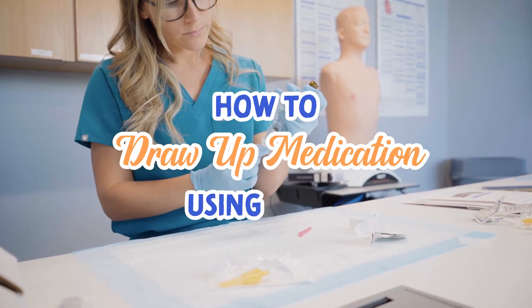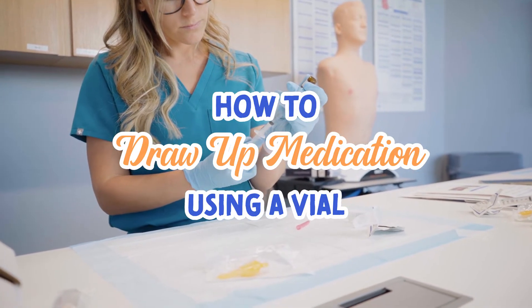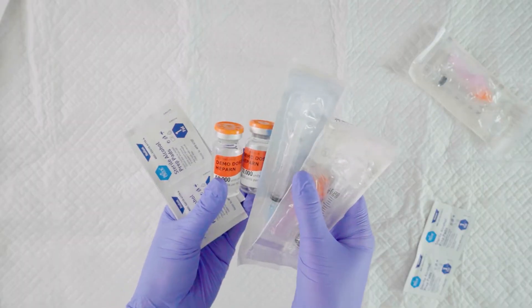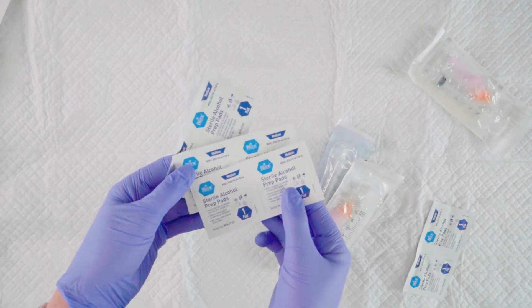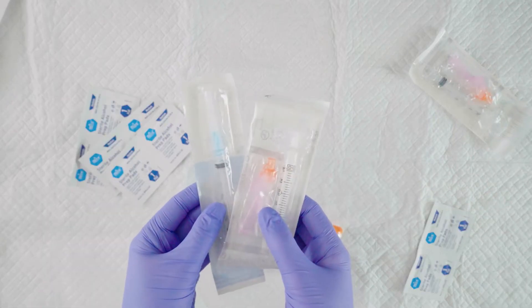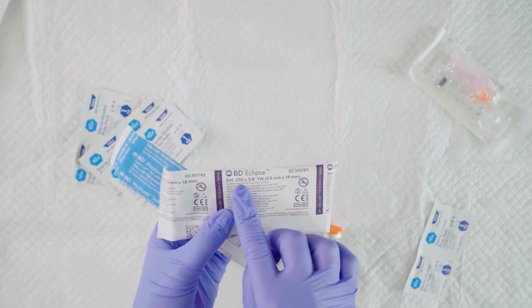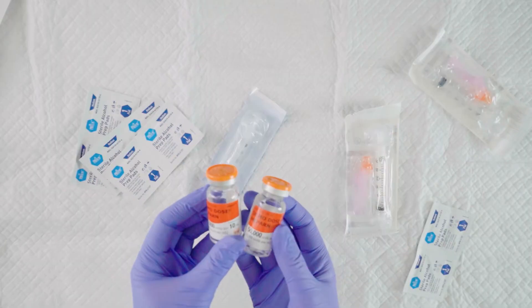How to draw up medication using a vial. Before starting, of course, hand hygiene. Then we'll gather our supplies. We have an alcohol prep pad, sterile syringes with needles for the sub-Q injection — this is usually a 25 gauge needle — and our heparin vial.